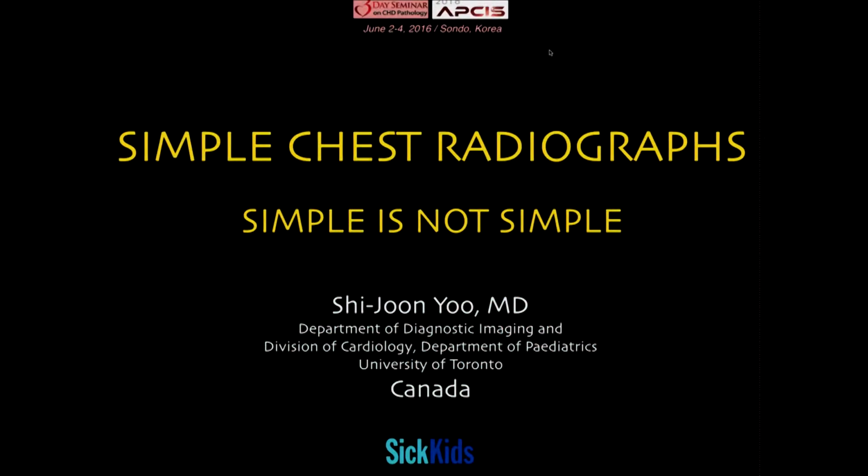Actually, I was given a very complicated title to give today. This plain film is a plain film. It is simple, but I was given this title by Dr. Sung-Ho Kim. So it's simple, actually.